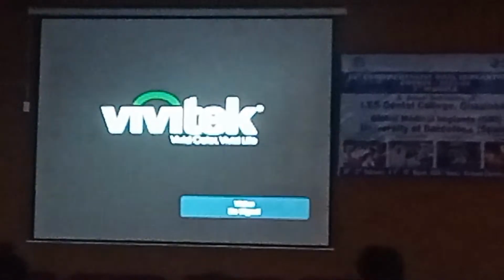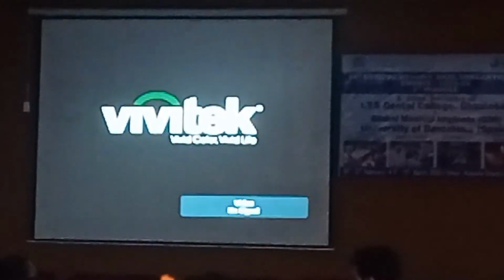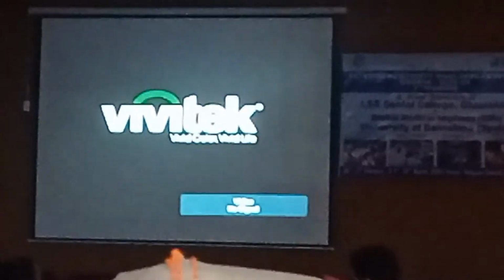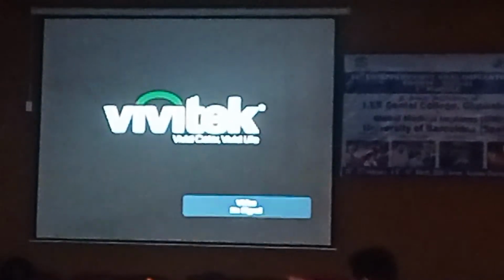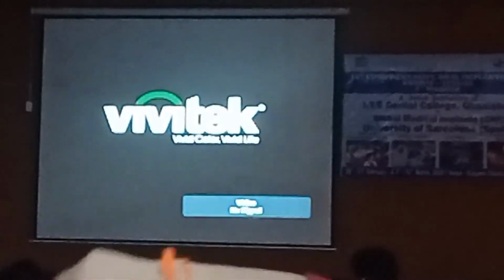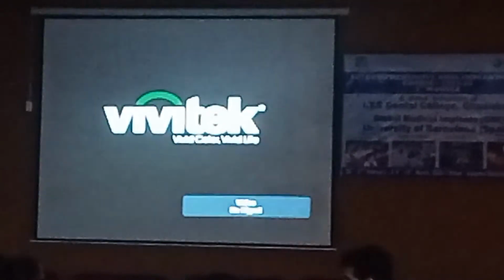Sir, it's not visible. Okay, one second. I'm just removing the healing caps anyway. So what I was trying to say is, just focus here. Let's see, this is number 7 healing cap, right? So I place my number healing cap separately and I should be able to place the same healing cap back. So I know this is number 6, this is number 7. Usually my assistant... Still not able to see. So there should be a marking here that this is number 6 and this is number 7. So I have to place it back in the right position, okay?